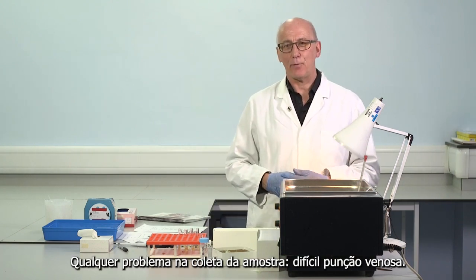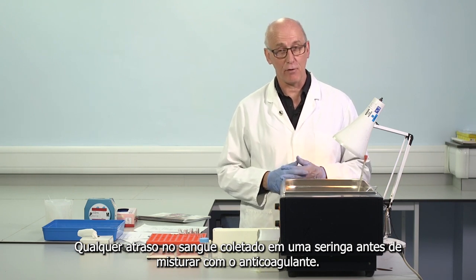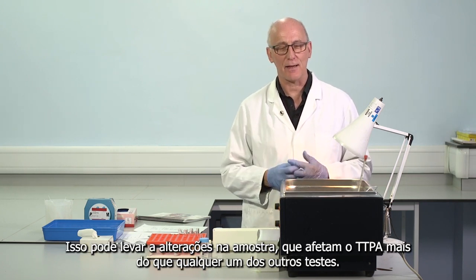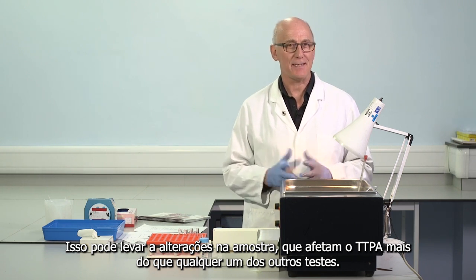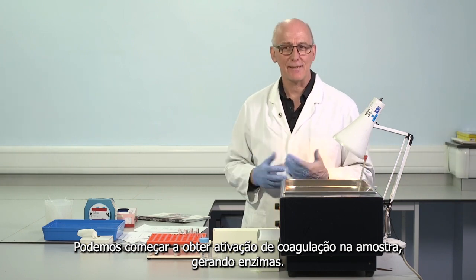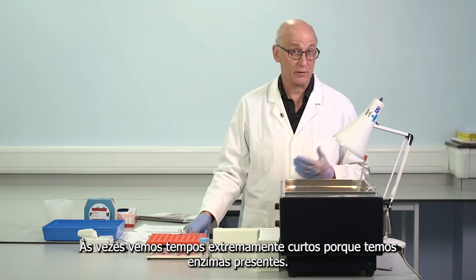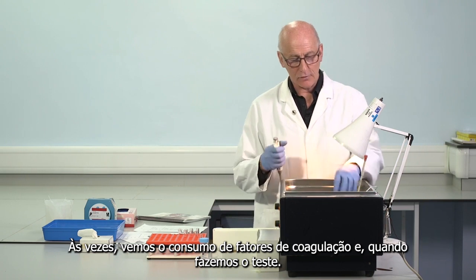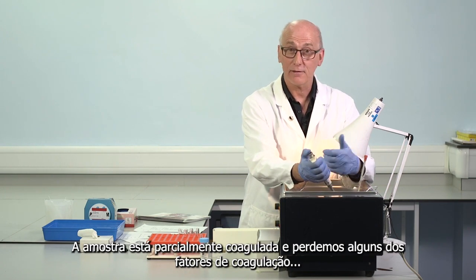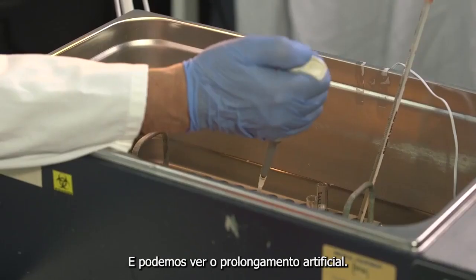Any problems in collecting the sample, difficult venipuncture, any delays in blood collected into a syringe prior to mixing with anticoagulant, these can lead to changes in the sample which impact on APTT more than any of the other tests. We can start to get clotting activation in the sample, generates enzymes, and it can mean when we make the APTT, sometimes we're seeing extremely short times because we've got enzymes present. Sometimes we're seeing consumption of clotting factors, and by the time we're making the test, the sample's partially clotted, we've lost some of the clotting factors, and we can see artificial prolongation.